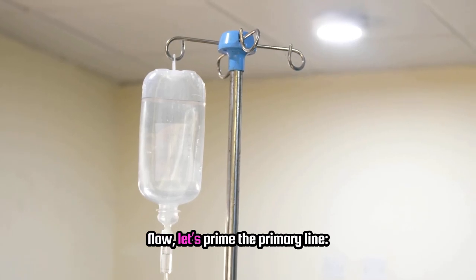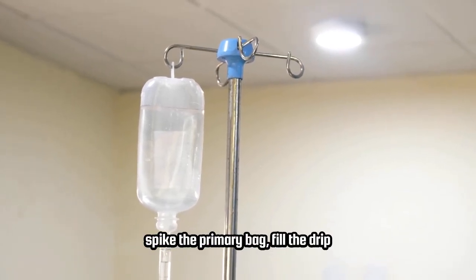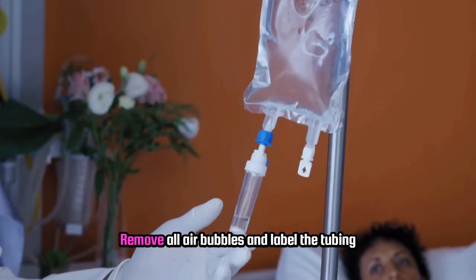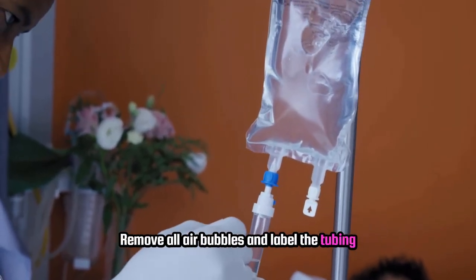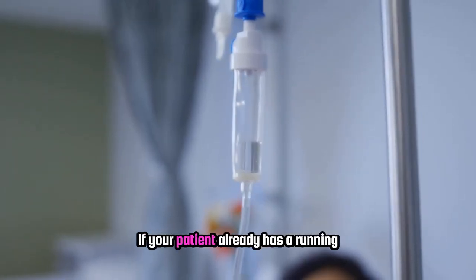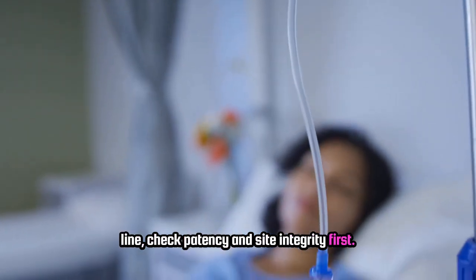Now let's prime the primary line. Spike the primary bag, fill the drip chamber halfway, and prime the tubing completely. Remove all air bubbles and label the tubing with the date, time, and your initials. If your patient already has a running line, check patency and site integrity first.